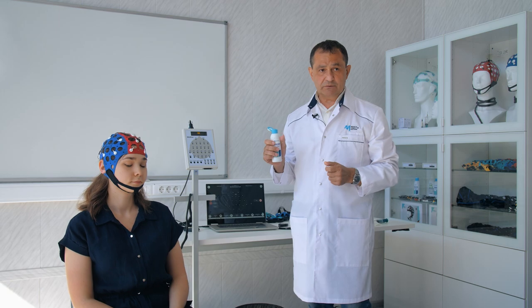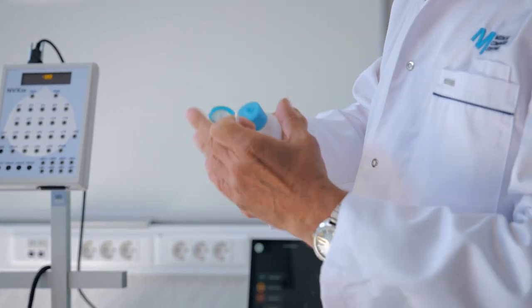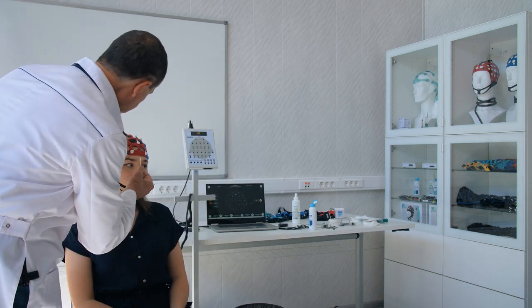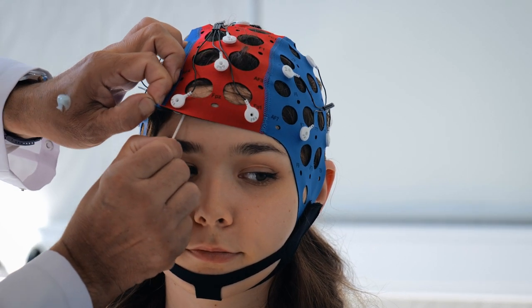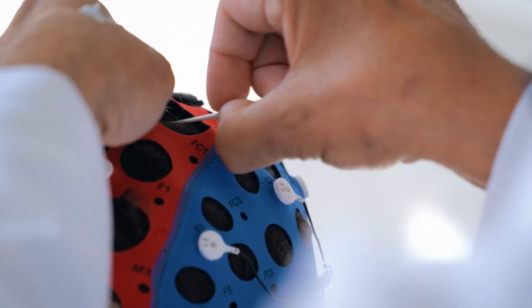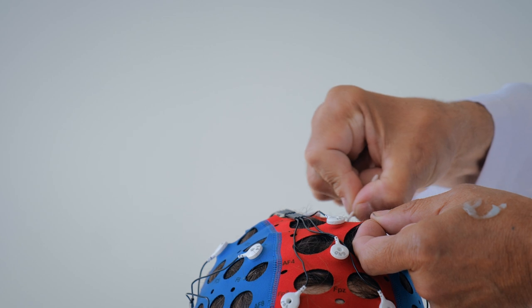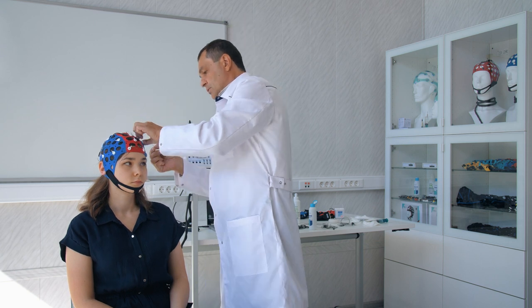Now we gently macerate the skin to ensure enhanced contact, accomplished using a unique scrubbing technique. The scrub is electrically conductive, so there is no requirement to wipe it off. It participates together with the gel in the creation of a salt bridge connecting the electrode and the skin. If needed, spread the hair to work the scrub in, and then gel is flowed into the electrode chamber, providing a salt bridge — contact between the electrode and the skin of the head.